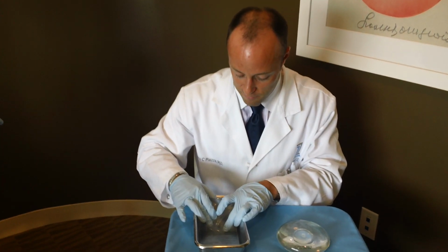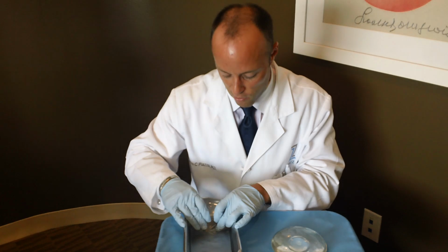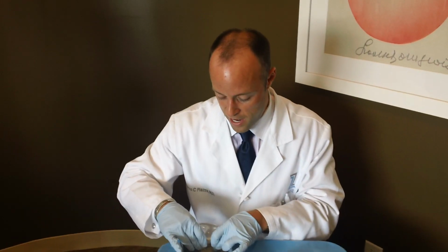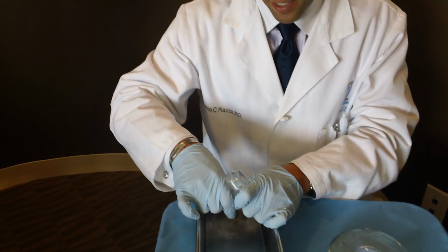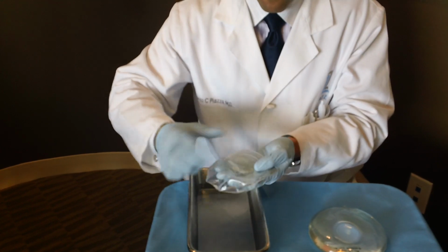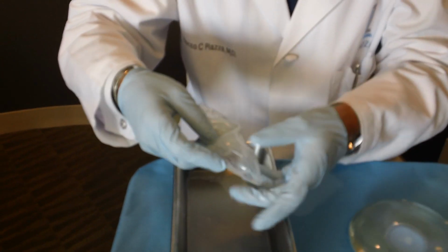So as this implant slowly deflates here, I'm going to show you what it looks like. It actually gets quite flat, which is really nice because it can allow us to place this through a smaller incision in the breast. This will be different as we compare this to silicone gel breast implants. So here we have a nearly deflated implant, and this was what would happen if for some reason the implant ruptured or had a leak. You'd be left with almost a near empty shell. And so what we're left with is just this outer silicone, just like this, okay? And when we place this inside the breast, we're going to want to fold it up and place it so you can see how the incision could be quite small in order to get this into the breast.